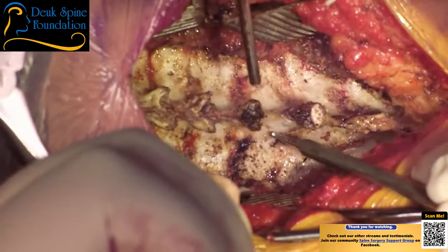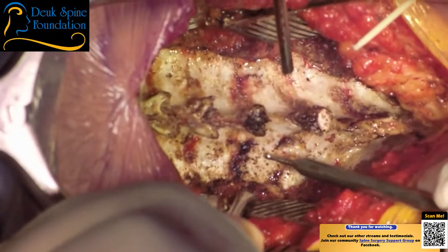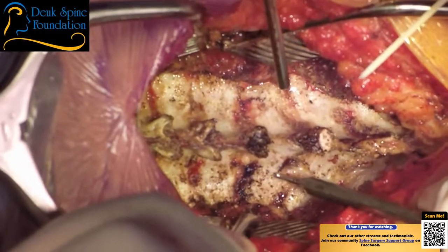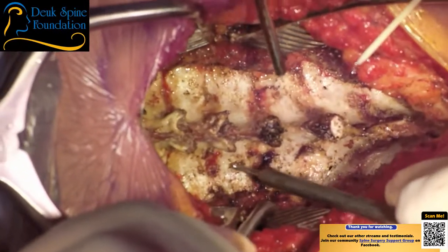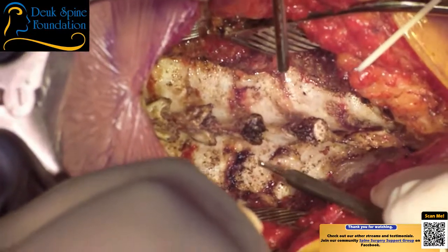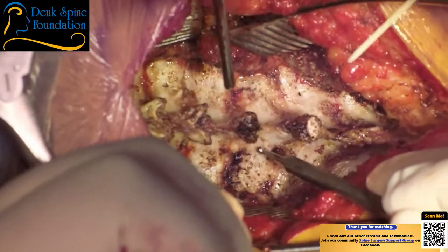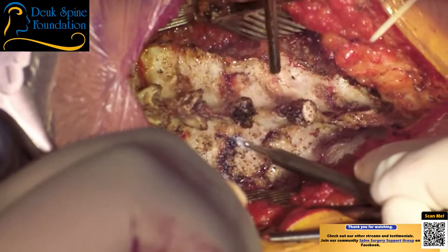All right, I'm gonna start at the spinal laminar line. So we got the lateral mass here, it ends right there. That's the lateral aspect of the cord. And so I wanna, you don't want to go into the lateral mass. That's a big mistake, all right? You want to make sure you just cut through the lamina, right, more conservatively towards the spinous process. We'll start at C7.